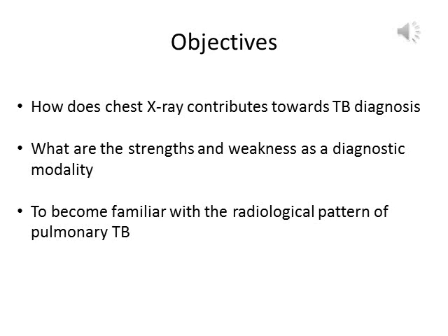The introduction of radiography as a diagnostic tool was a landmark in our knowledge of the natural history of tuberculosis and its diagnosis. It is therefore no wonder that the enthusiasm with which chest radiography was received and applied sometimes caused the method to be overrated. It is still widely believed that pulmonary tuberculosis can be diagnosed by chest radiography alone.